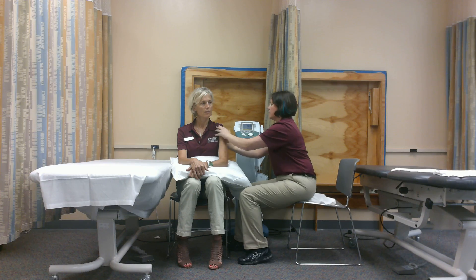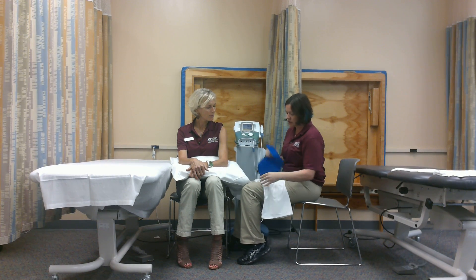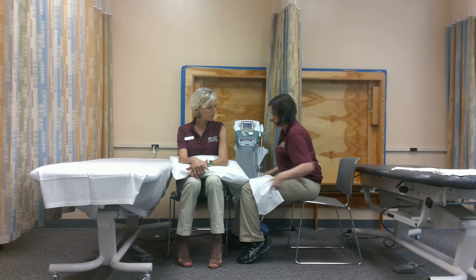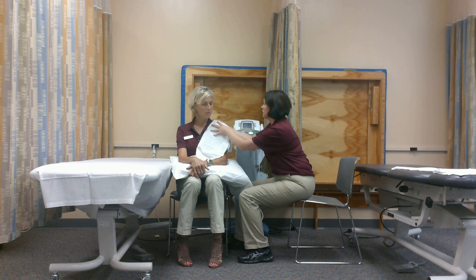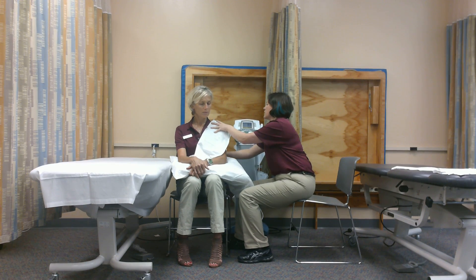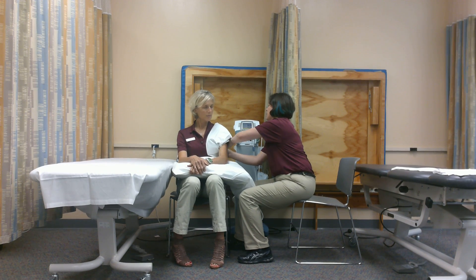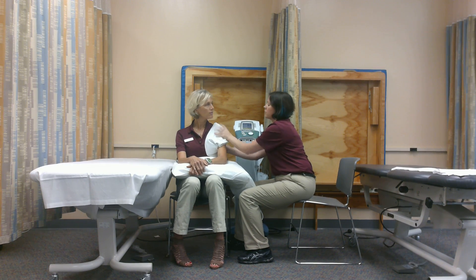I'm going to expose the area, then take the ice pack in my single layer barrier and place it here. I'm going to tuck it so that Hunter doesn't have to hold onto the ice pack. We're going to go with a treatment time of about 10 to 12 minutes so that we get the full effect.